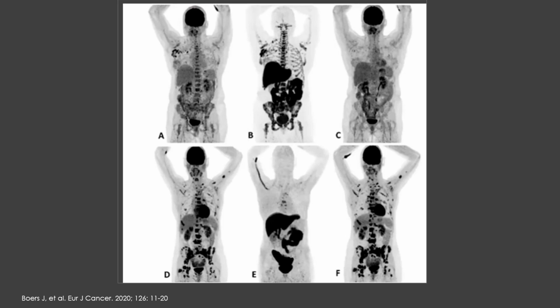The prognosis was good for that patient. In row 2, that patient is a non-responder to hormone therapy.